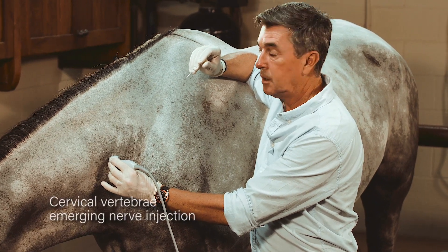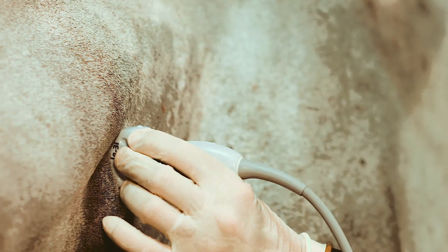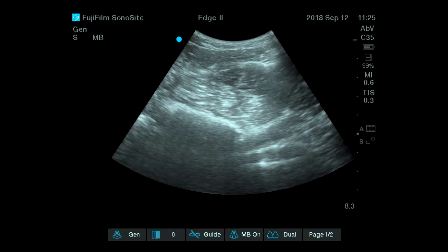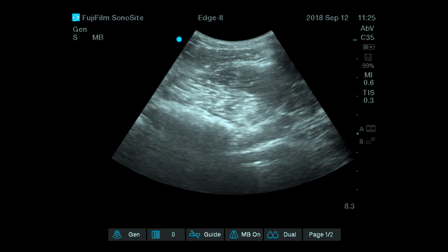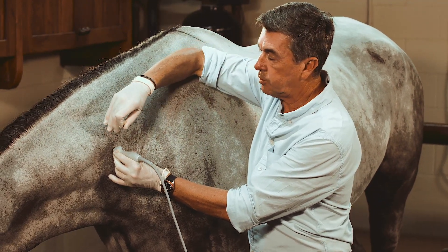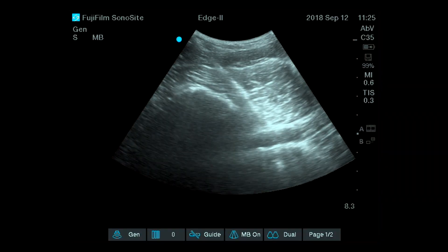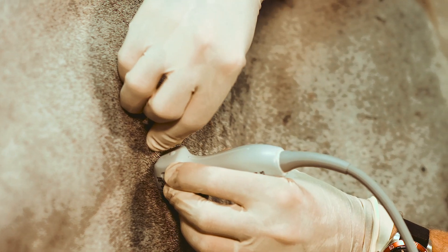For this particular injection it's going to be a little bit different. You want to see with the same axis the probe within the facet — let's say C6-C7 or C5-C6 here — and we are going to orientate the probe a bit more caudally and oblique to see the very deep structure, which is the nerve emerging from the facet joint and the foramen. This will be a bit more caudal to the facet in the axis of the vertebral body. The idea is to put the needle, once you see the nerve, sliding below and behind the facet joint — so the needle will be aiming caudally to the facet joint and aim directly on the nerve root.